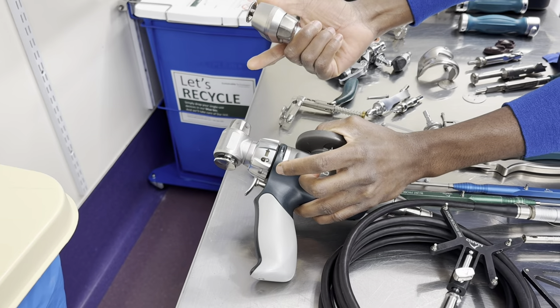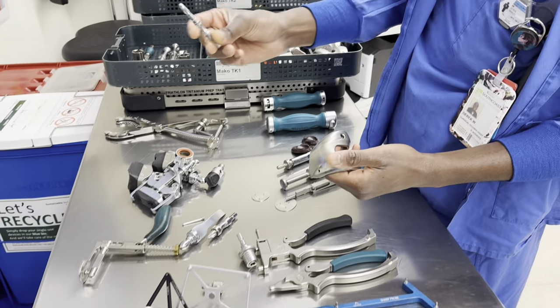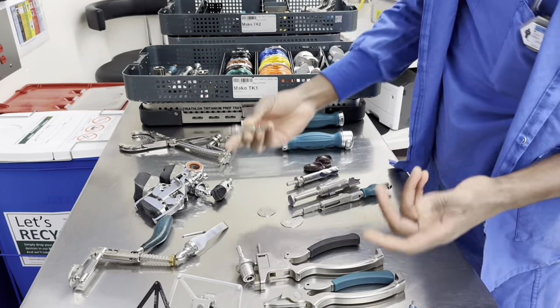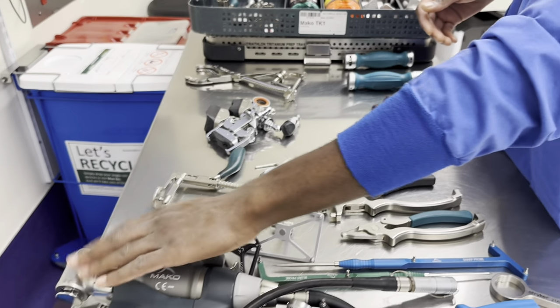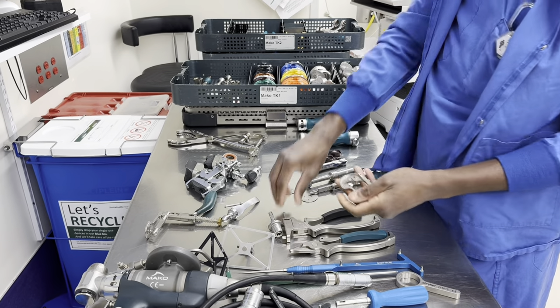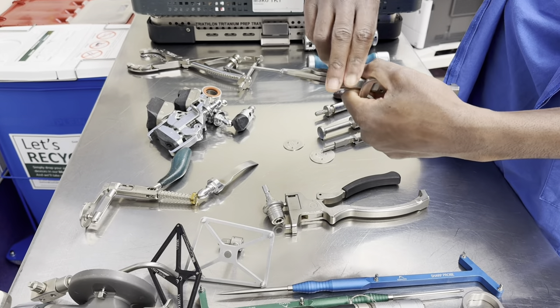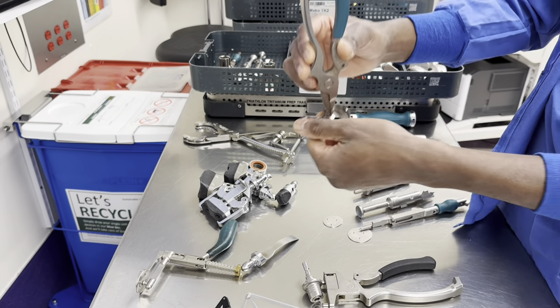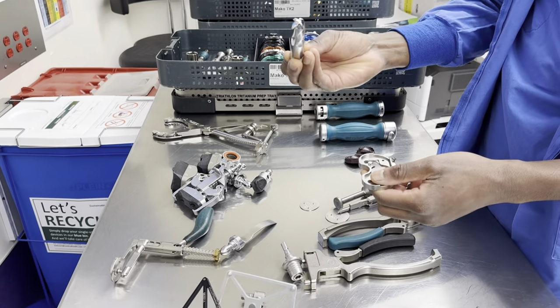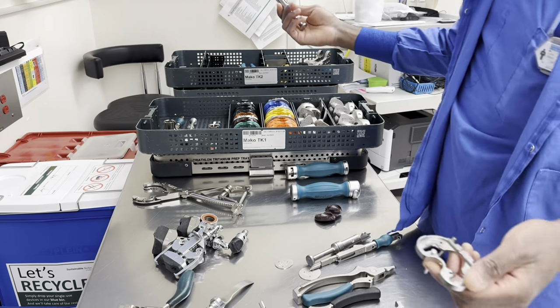For the femur, you put the saw onto the two Mako attachments to make the cuts, then the femur is ready for the trial. Check that you like it with the trial, then drill with the femoral drill through those holes — and your femur is ready for the implant. For the tibia, make the Mako cuts, then trial the tibia. Put in the two pins with the pin driver to hold the tibial trial in place. Then use the tibia drill first, followed by the corresponding tower for the size, then the punch — and your tibia is ready.